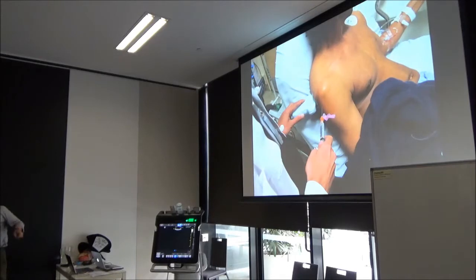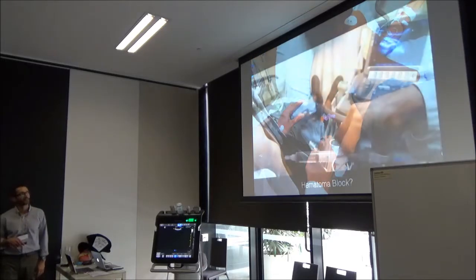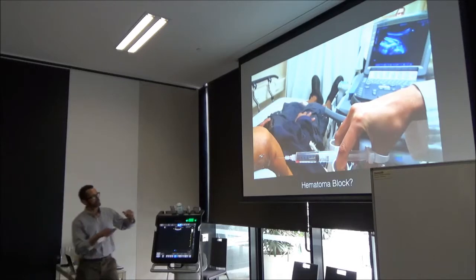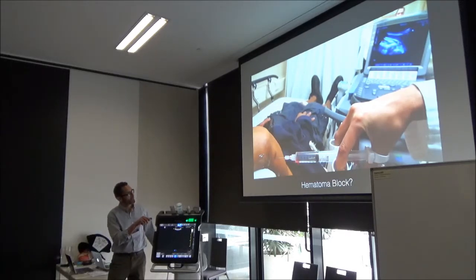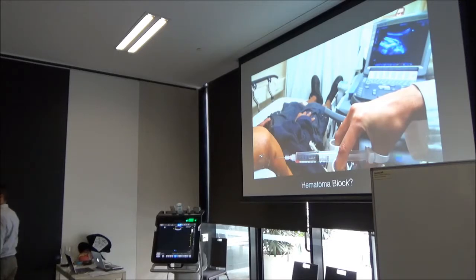You can see this gentleman has a dislocated shoulder, he has a kind of flattening right there. She has the probe posteriorly, parallel below the spine, and she's putting in a little bit of local. And then, here's something I want you to point out, which is something I didn't realize. See this little blush right here? See, she's using a long needle. Who's injected a joint and tried to reduce it? I used to do it, it never worked for me as a resident.